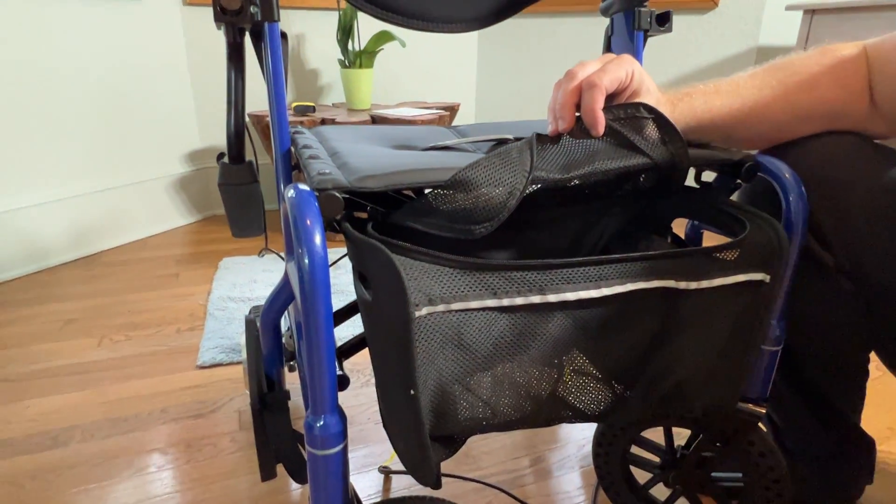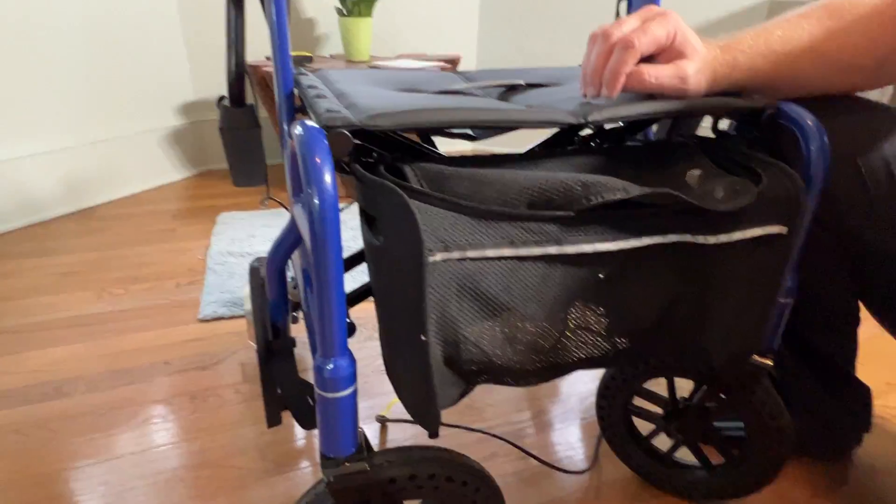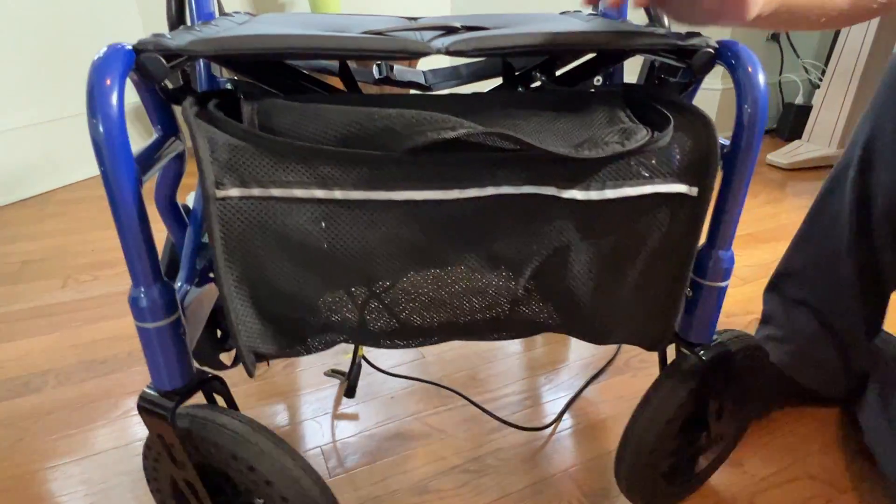And of course when you have the basket on, you have a sufficient and ample amount of storage space in the basket underneath the seat as well.